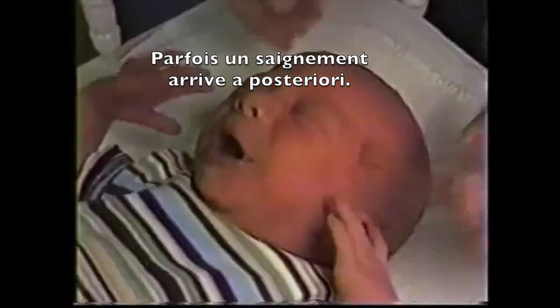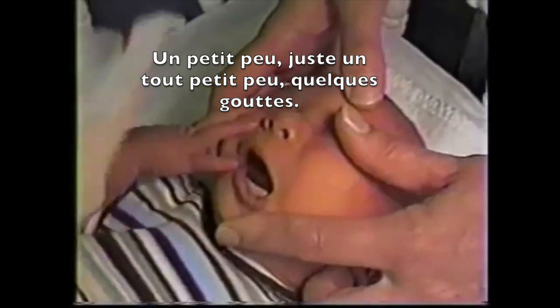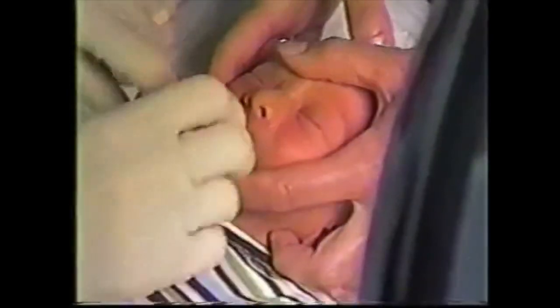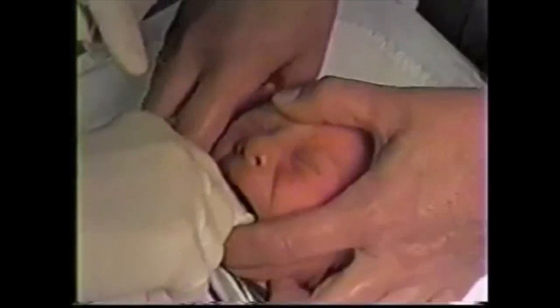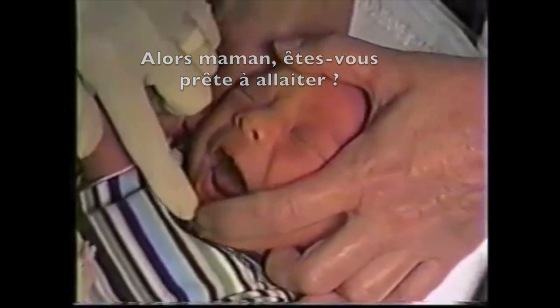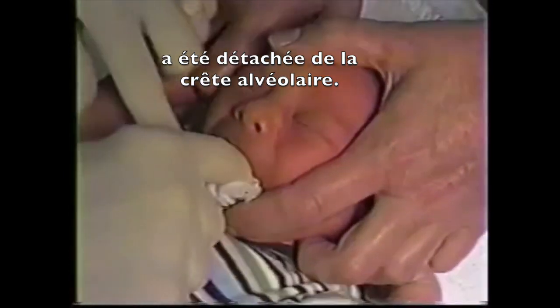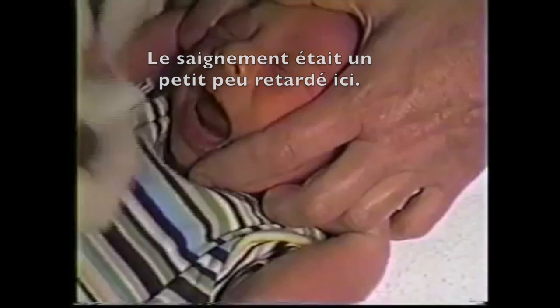Sometimes bleeding is a little bit delayed — a tiny bit — and you get a drop or two. When he cries, you can see that the tongue has been detached from his gum line. The bleeding was a bit delayed in this one.